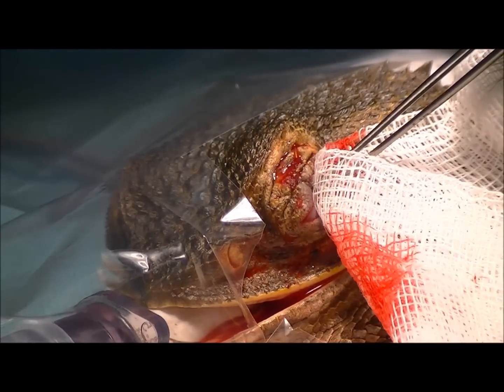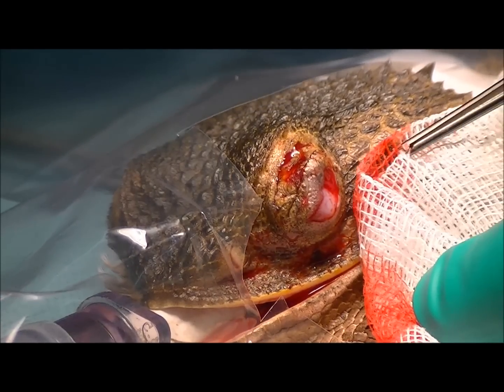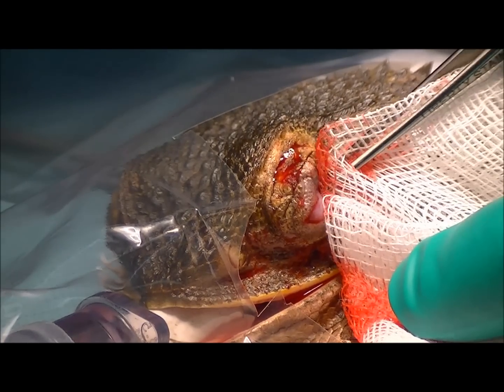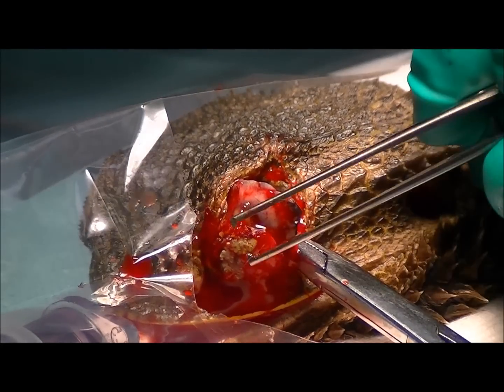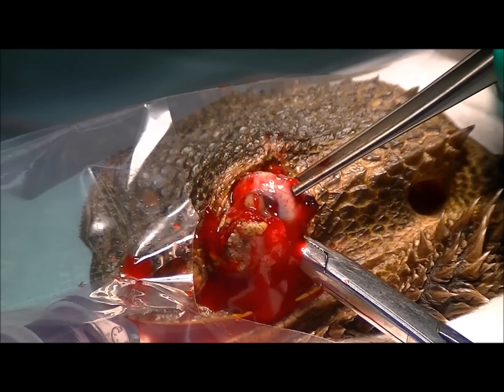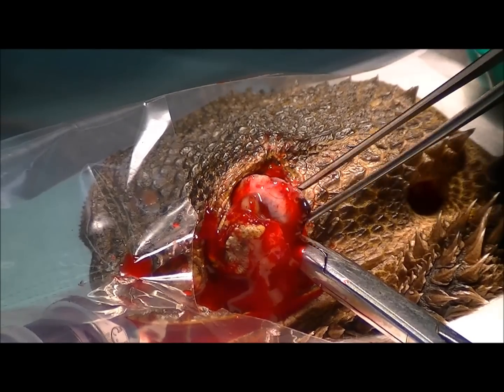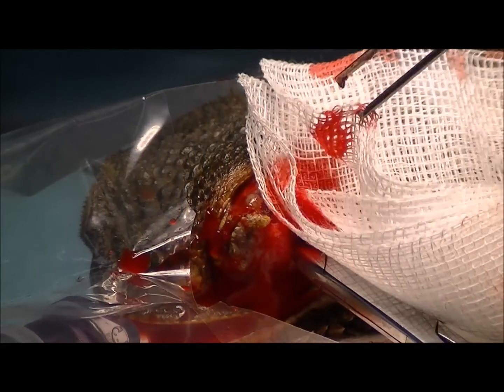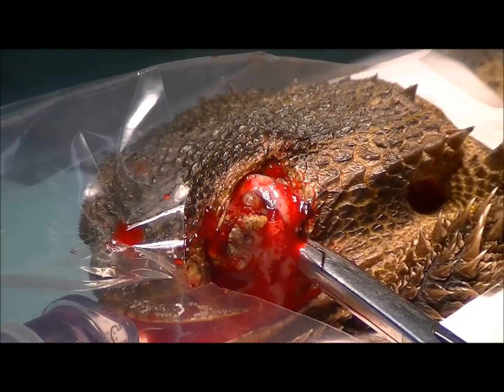They have a pretty good blood supply so they tend to bleed a little bit. You can see here that's the skin, and this paler white tissue is what's called the conjunctiva — we're going to go down beside that and try to remove the eye completely surrounded by that tissue. The eyeball itself was actually quite friable and just fell apart as I touched it, so the actual eyeball has fully ruptured. We're working our way down behind it. There's a bit of blood — these guys tend to bleed — so we have to minimise that. The clamp here is clamped onto a blood vessel at the back of the eye to try and prevent or minimise that bleeding.